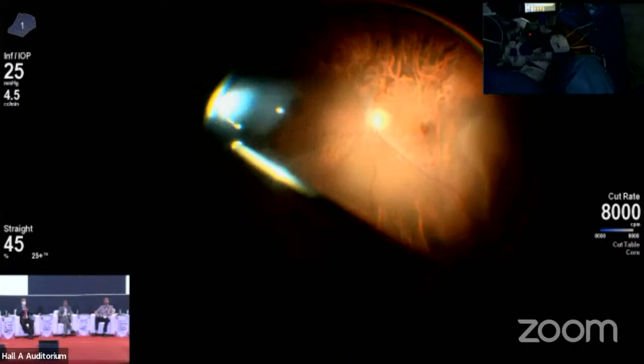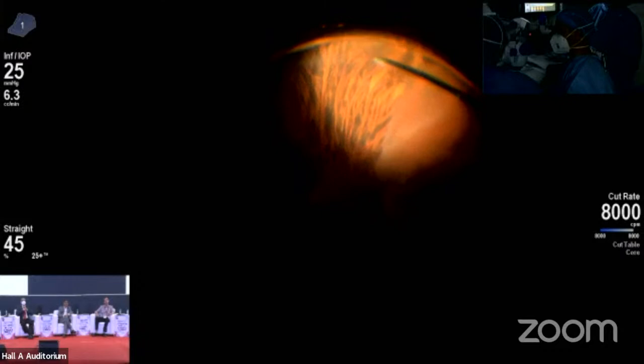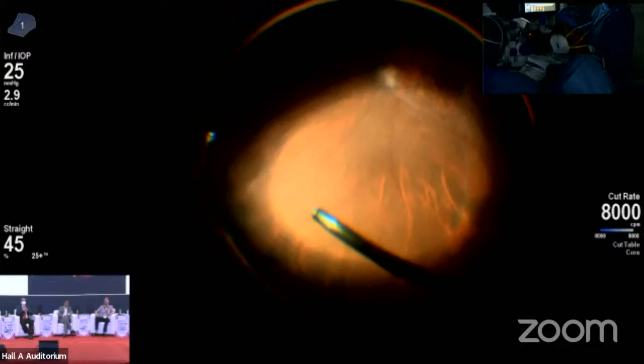Vitrectomy may be a little difficult once you go in the area where the retina is detached, because retina tends to flutter. So in such cases, usually I would do the vitrectomy first in the area where retina is attached and then go to the areas where retina is detached. Vitrectomy is very important in these cases. You have to do the complete vitrectomy.